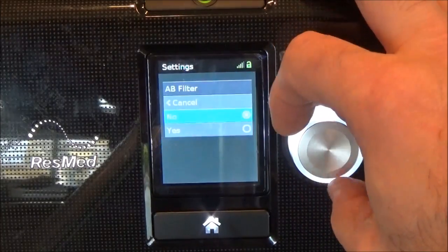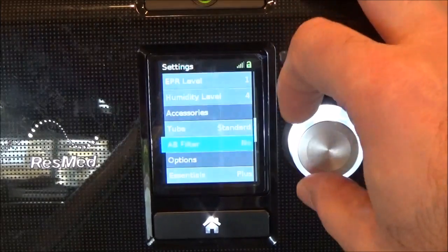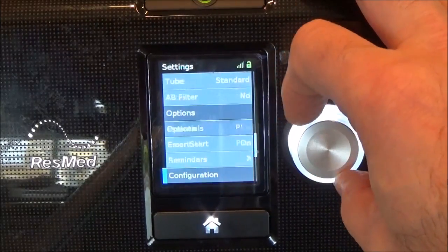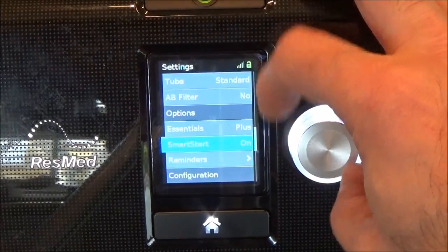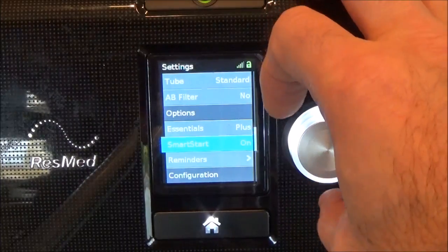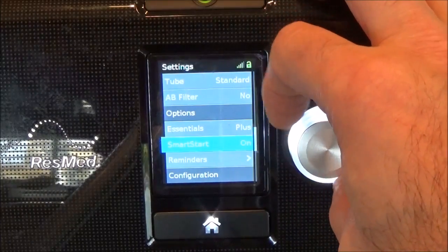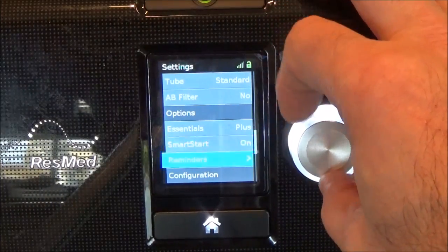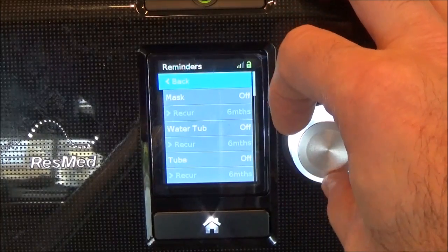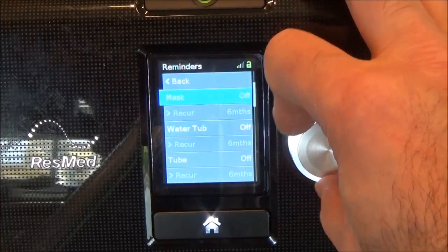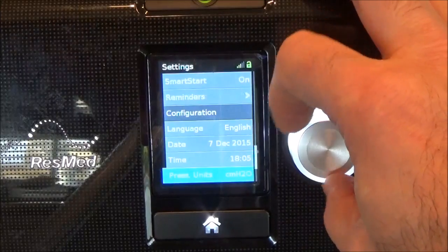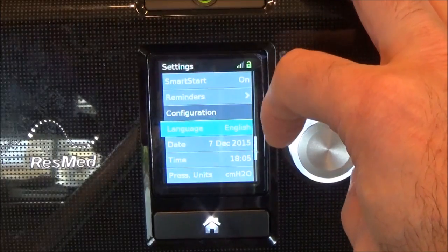Antibacterial filter — do you have one in there? Yes or no. Smart start is when you put the mask on and just start breathing — it will turn on automatically. That's on; you can turn it off if you want. Mask reminders and similar options. You can select your language — English.